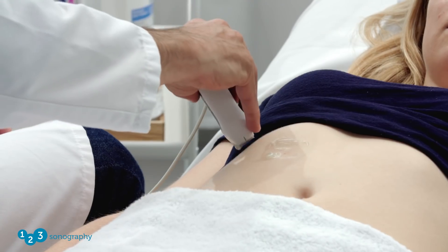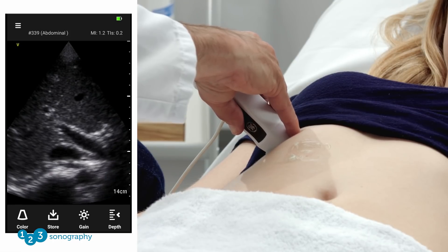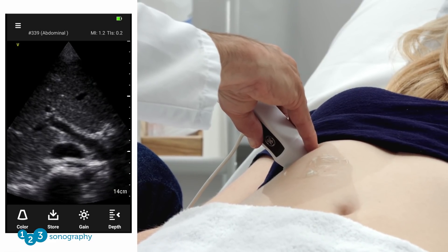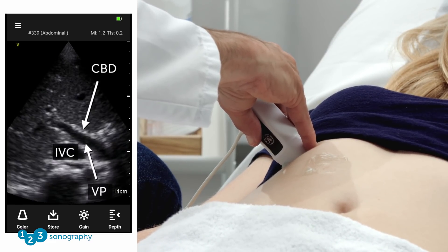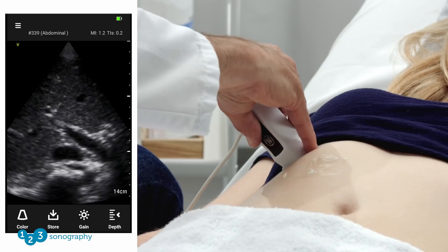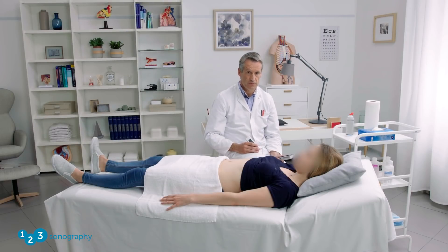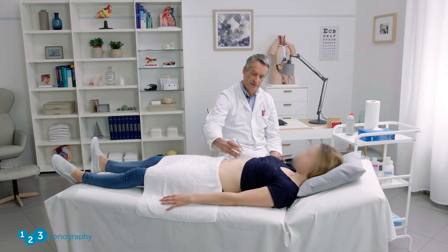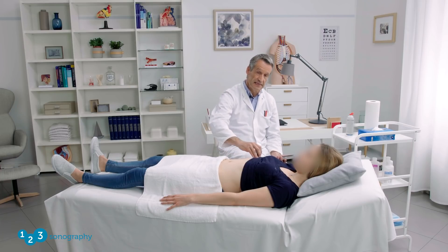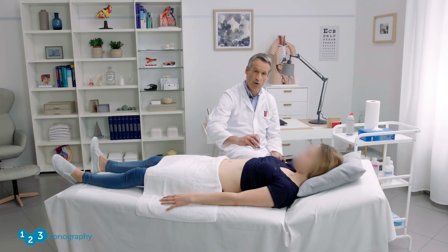Changing the imaging position to the intercostal oblique view, you can again easily visualize the portal vein with the common bile duct running parallel to it. In summary, imaging the gallbladder and the biliary system is very important. There are several imaging positions to visualize them, but remember: the easiest way to visualize the gallbladder and the common bile duct is the intercostal oblique view.